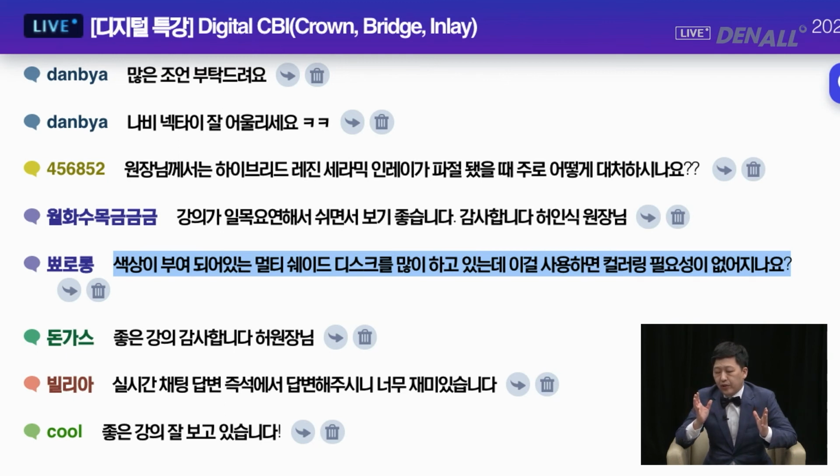The multi-layer disc, the shades are set so that it fits the average color and it cannot recreate the different characteristics that different patients have. It is much more aesthetic than the monocolor or monolayer, and it really reduces the load, but you cannot say that it ensures aesthetic results.